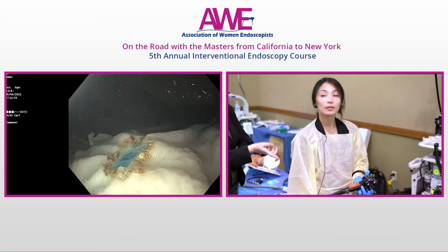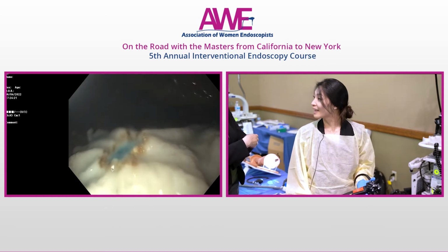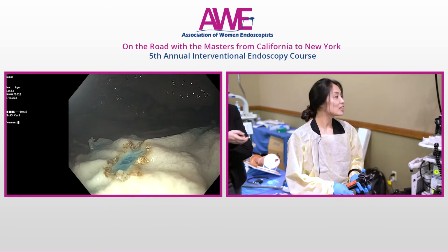And we were planning to make it even more perfect, right? Yeah. With the Purostat. Yeah.